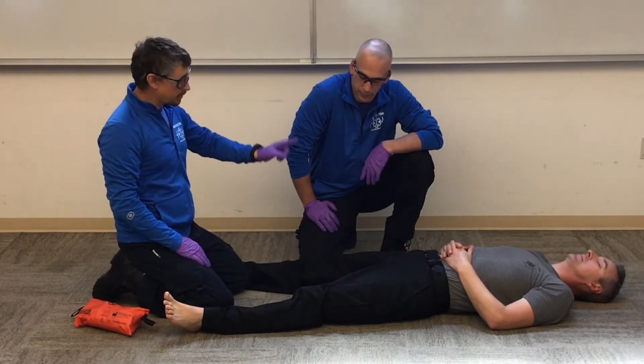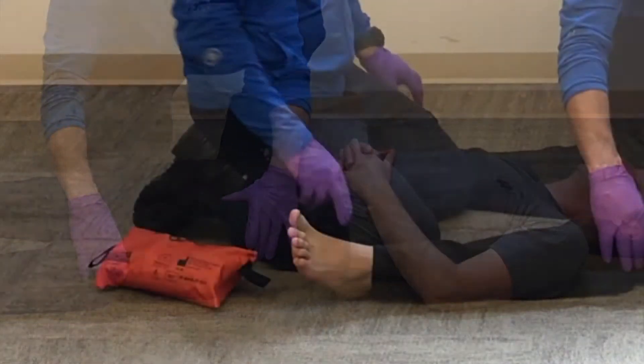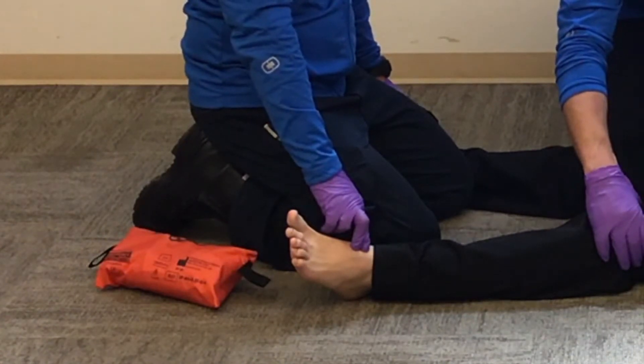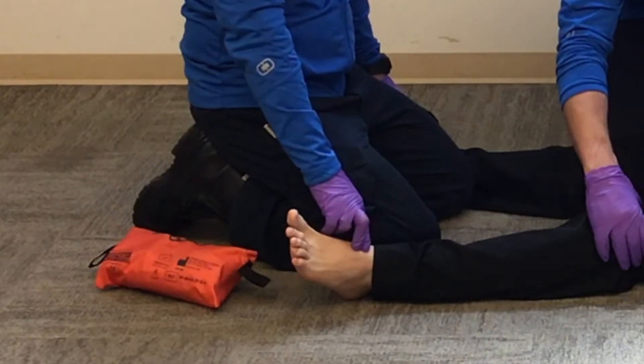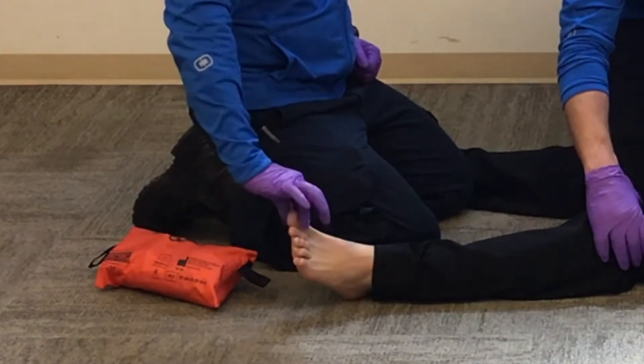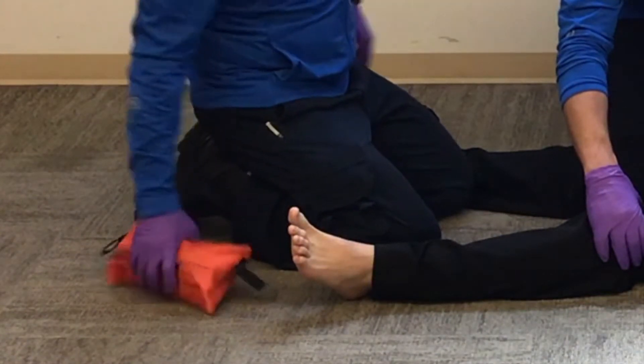I'm going to have my partner hold manual stabilization of that injured extremity. I'll check my CMS, comparing my pulses — got good equal bilateral pulses. Can you wiggle your toes? Can you tell which toe I'm touching? Big toe. Can you tell which toe I'm touching? Little toe. All right.